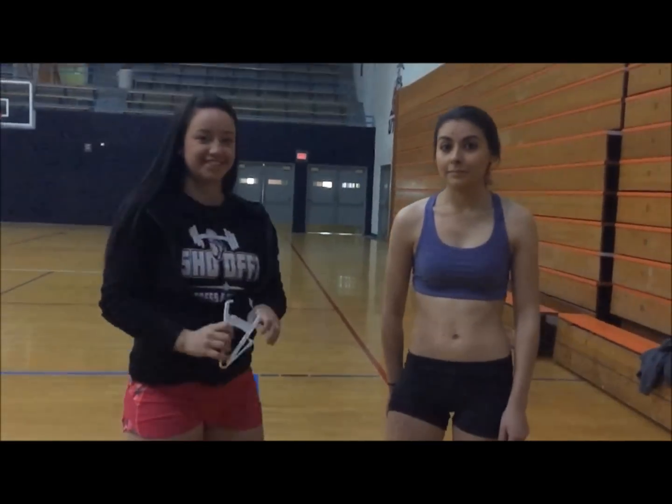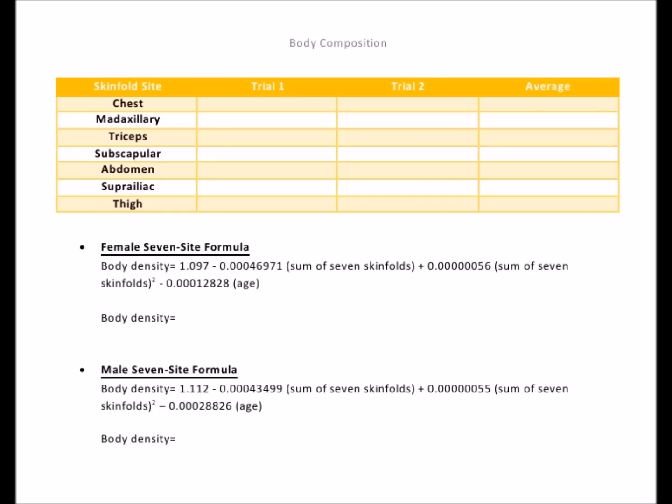Make sure to record all your measurements, and there is your seven-site skinfold test. Here is something that I created to record your measurements that you can follow. You may take up to two trials to get an accurate average, but make sure to rotate through measurements to allow skin to go back to normal thickness and texture. Male and female equations are listed below to help you calculate body density for the subjects.